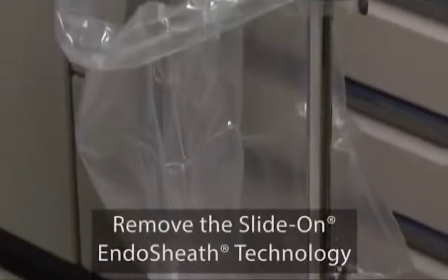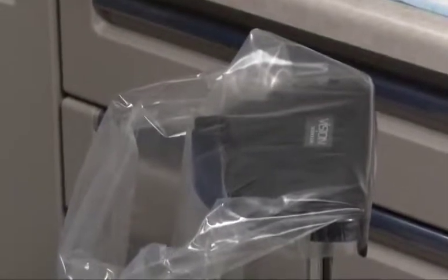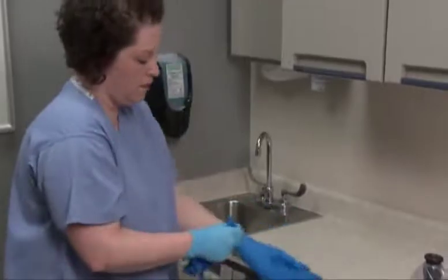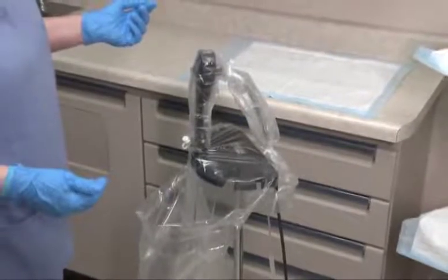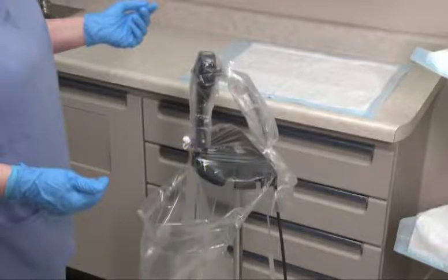Always use the installation stand to remove the endoscope from the sheath — attempting to remove the endoscope without using the installation stand could cause damage to the endoscope. Put on two pairs of clean gloves. Ensure that the drape bag completely covers the installation stand. Slide the endoscope and sheath into the installation stand with the accessory port facing toward you. The contaminated sheath insertion tube must be contained within the drape bag to capture and contain any patient material and/or fluids.